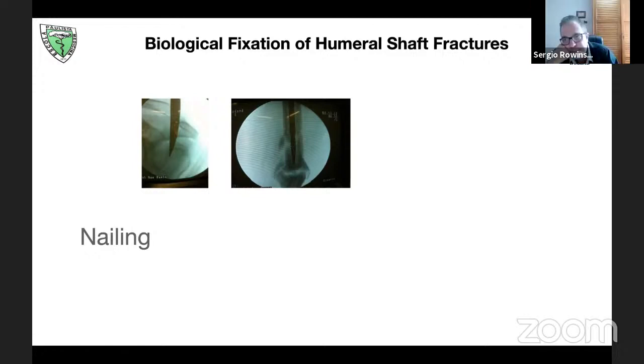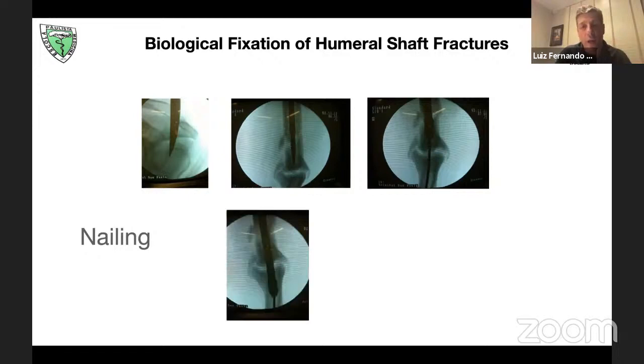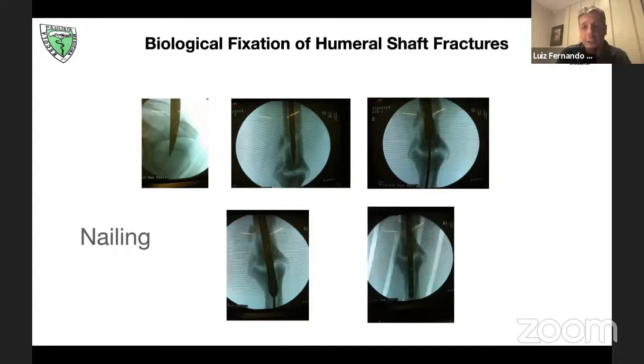So this is a reamer that I used on a tibia fracture. It's a rigid one. So in my mind, the big deal here is not to ream the proximal fragment, but the distal fragment, because the shafts were closed with the non-union. So I use a rigid one to open the canal, right? And then I use the wire and ream all the shaft, and then I use the nail.